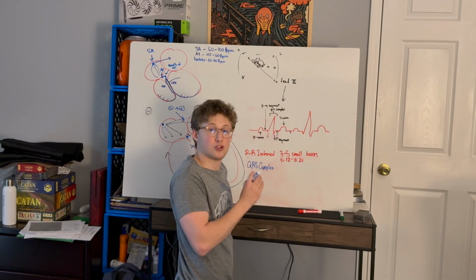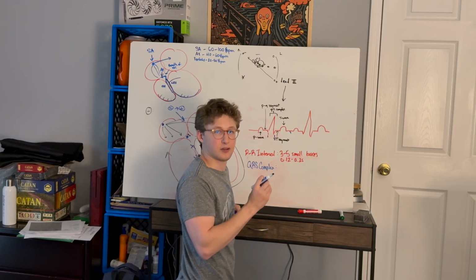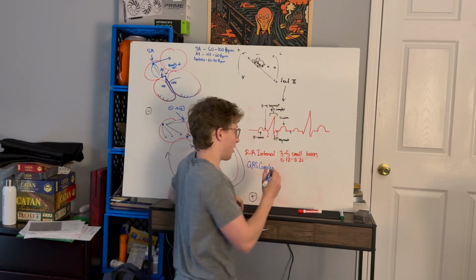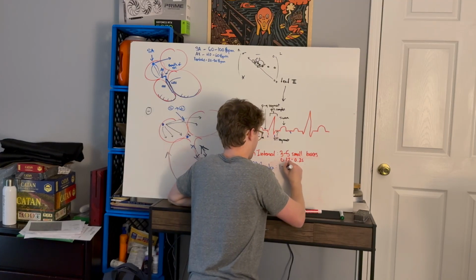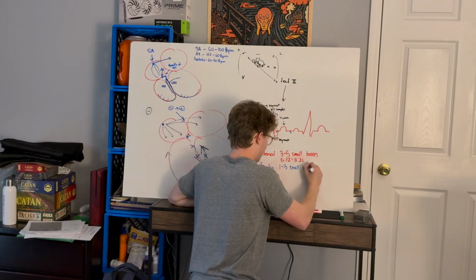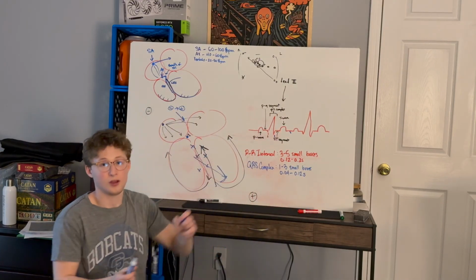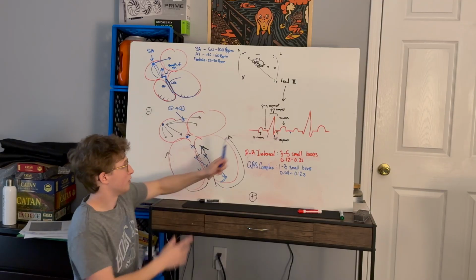QRS complex should take between 0.04 and 0.12 seconds, 1 to 3 small boxes. QRS complex.